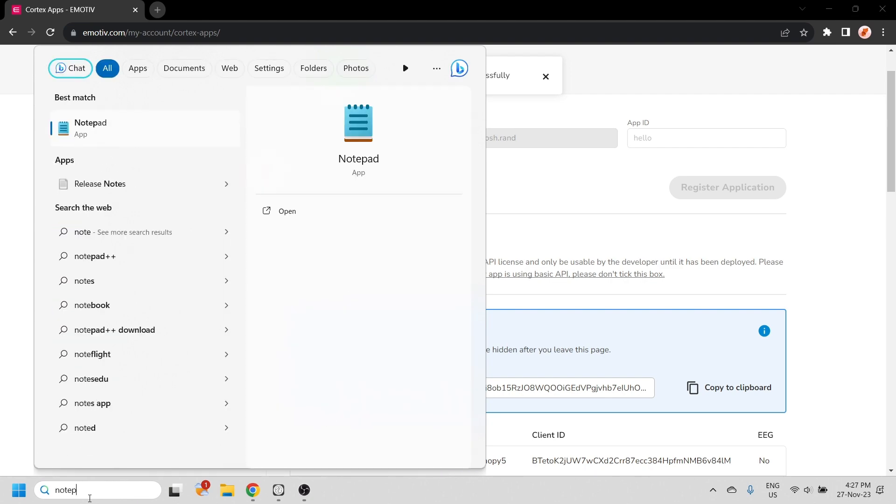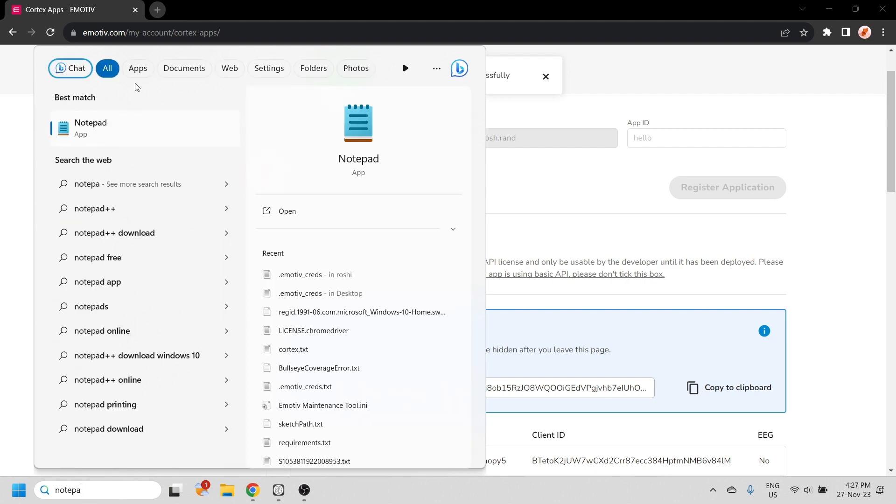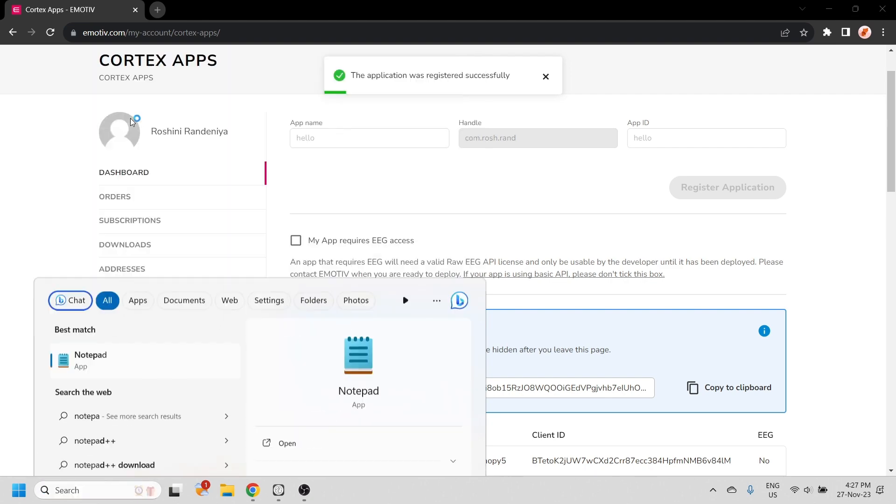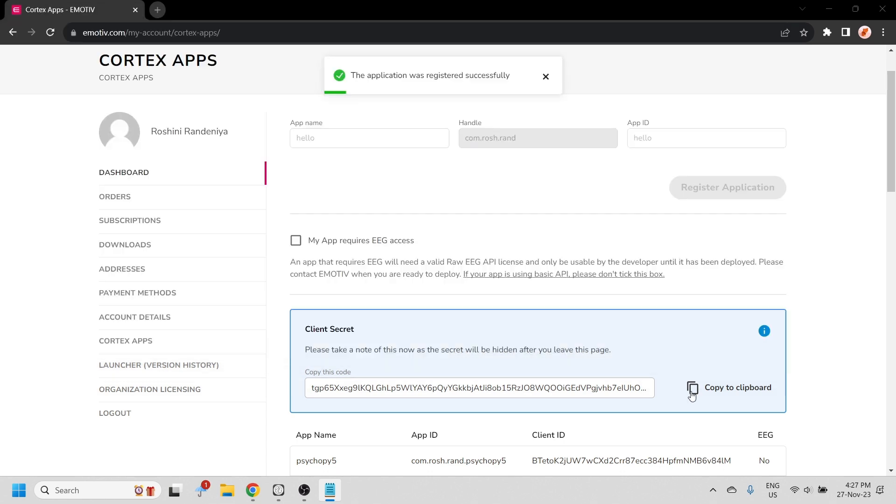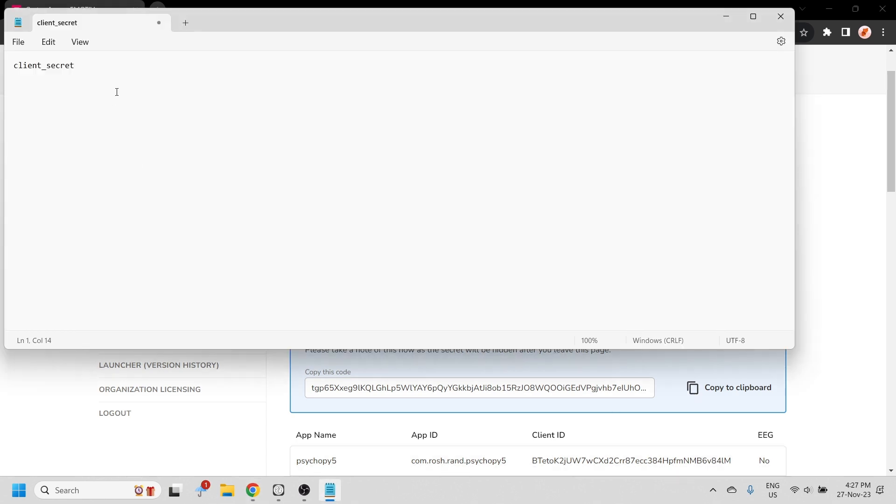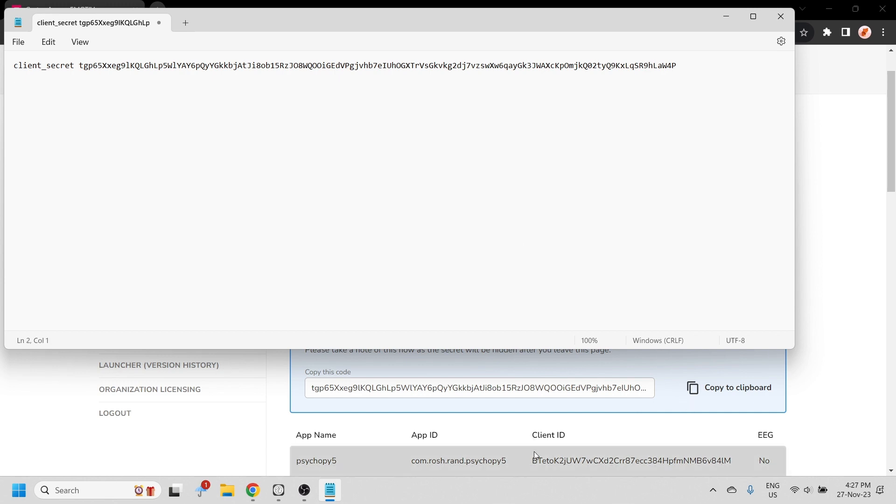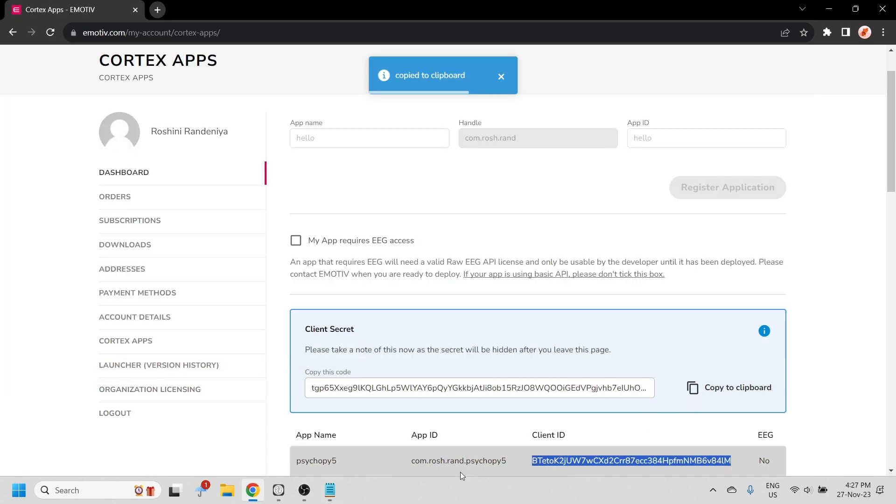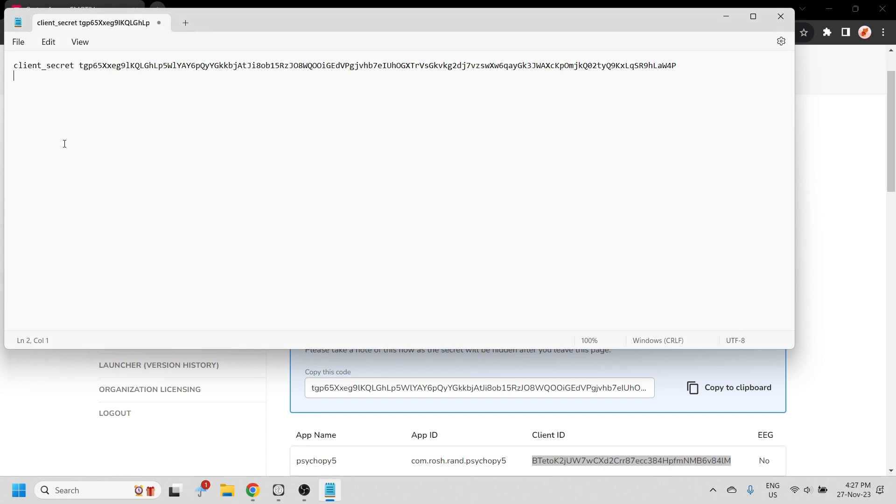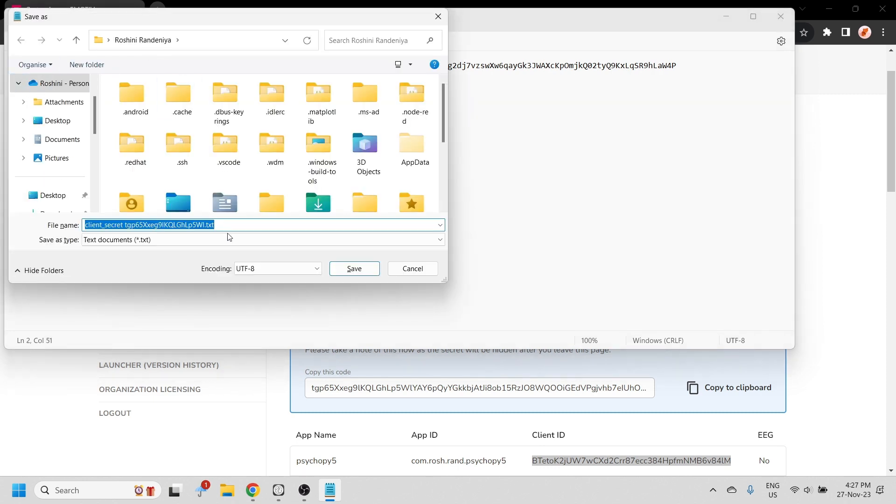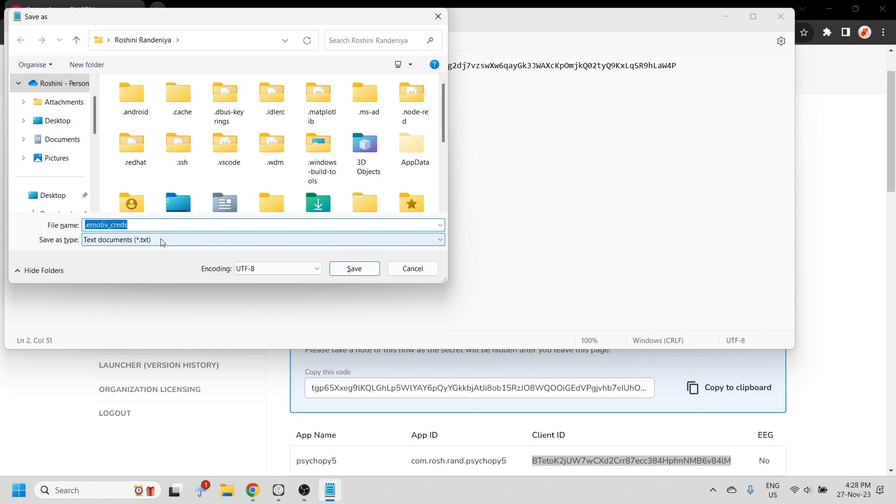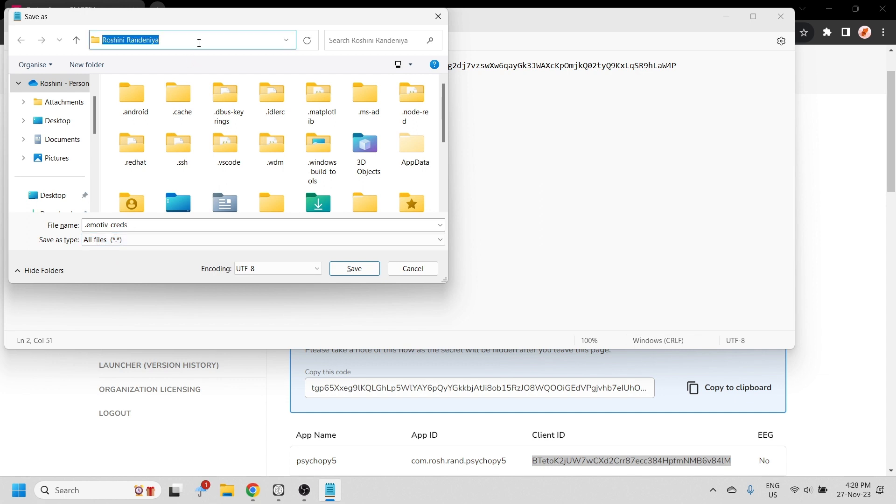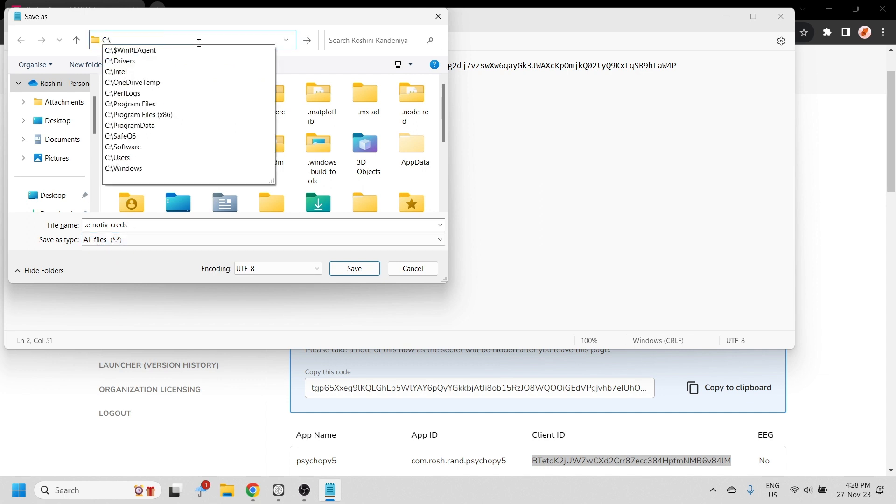Open up any text editor, like notepad, and enter the details here. Save the file as .emotiv_creds. Remember to select all files so that the file is not saved as a text file, and save this in your home directory.